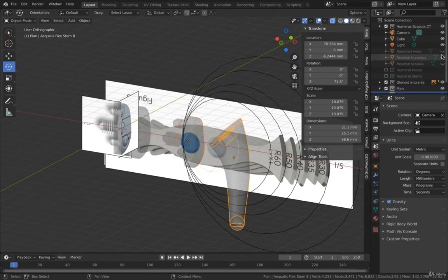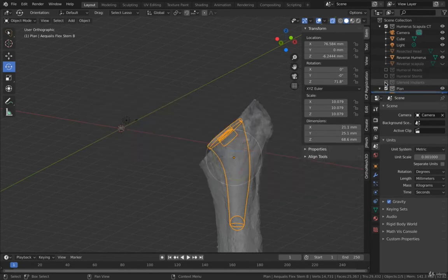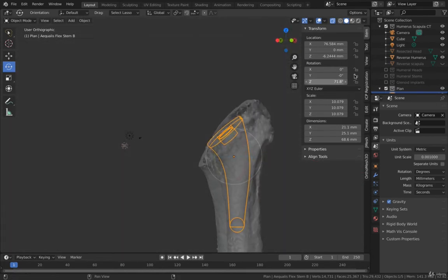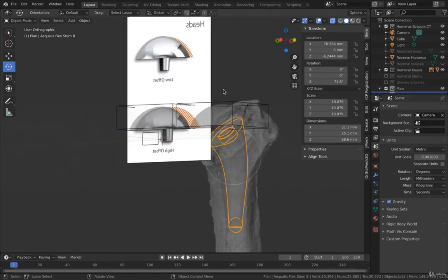Excuse me, I have to use the humerus. We have to be able to use the humerus. So we don't need the glenoid implants because we have finished that. Now we have to bring in the humeral heads. So I'm going to bring them in, and now you can see them.